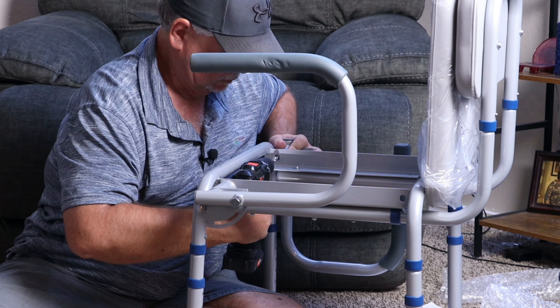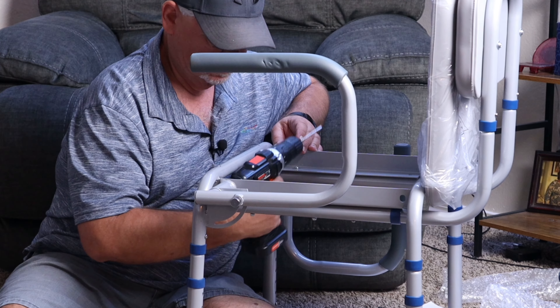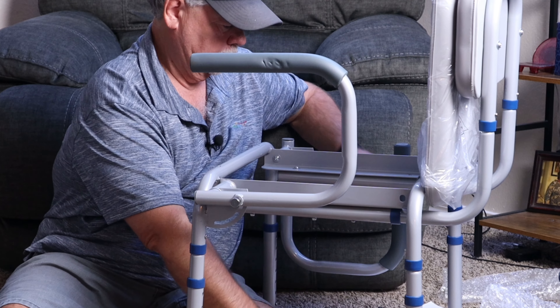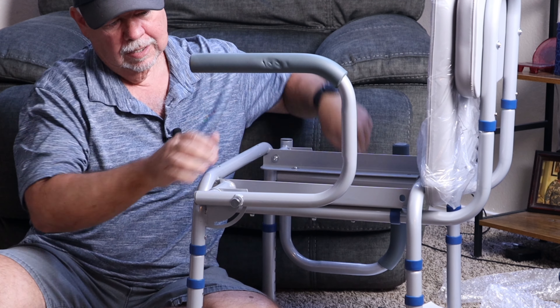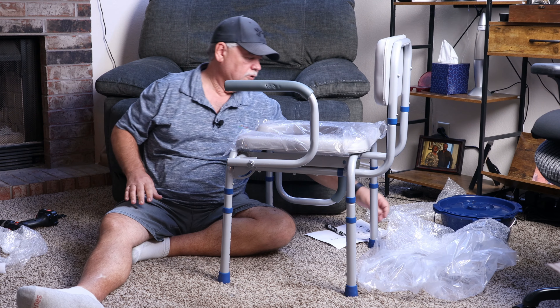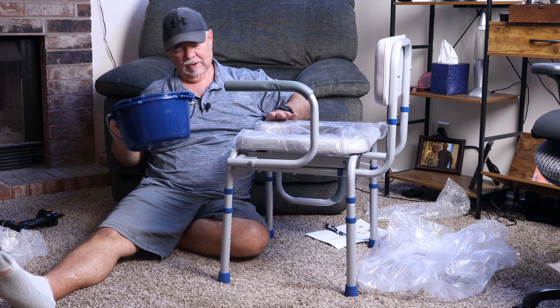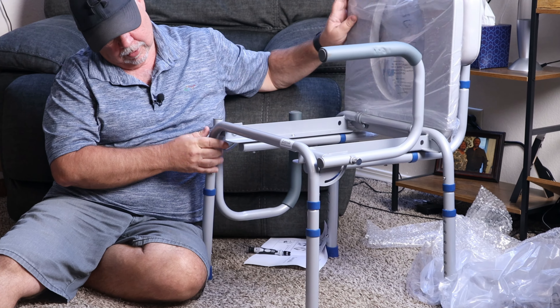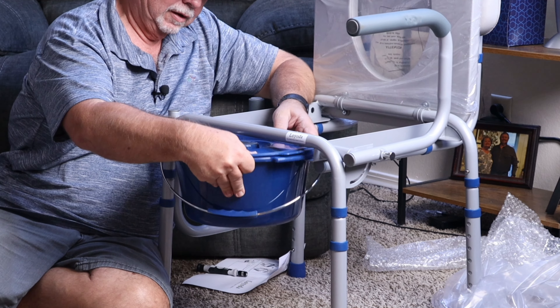We forgot our washer — make sure you get that washer on there. Those work nicely. A little stiff, but it's because we've got that screw in there tight. That is pretty much it. Like I said, it holds up to 400 pounds, and this, I believe, is a 6.3-quart bucket. You can just take this — it's got slides right here — and you will just slide this in just like that, slide it into place.